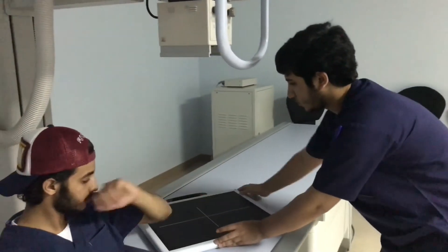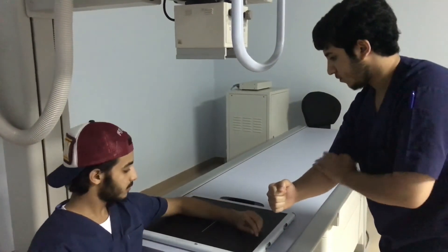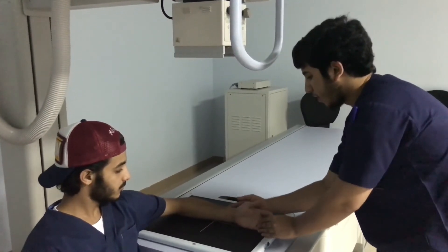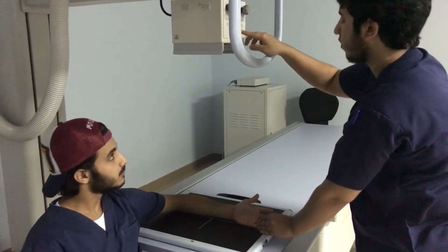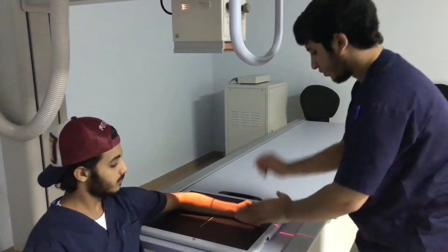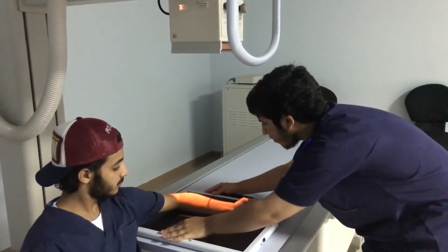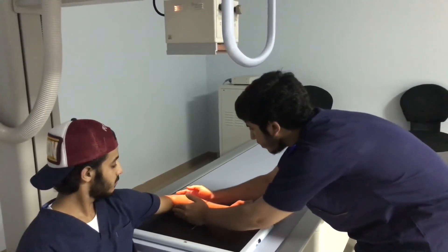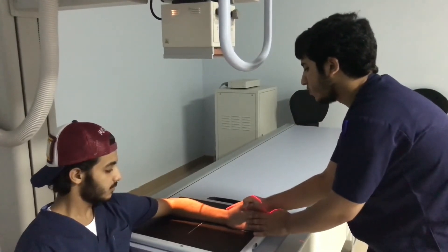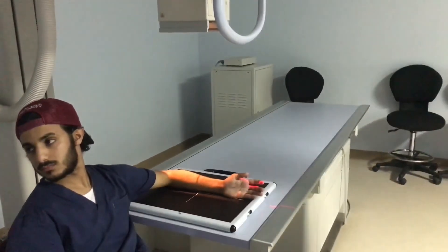For example, we rotate the receptor to make sure that the center of the forearm is aligned with its long axis, and the center ray is perpendicular to the mid forearm. The specialist turns the patient's head away and proceeds with the exposure.